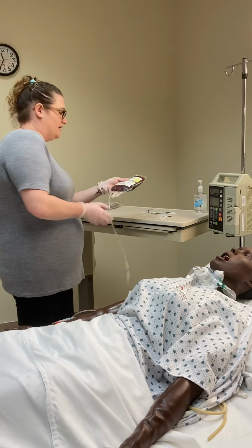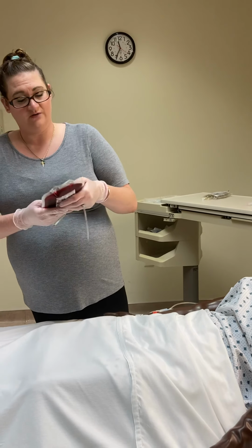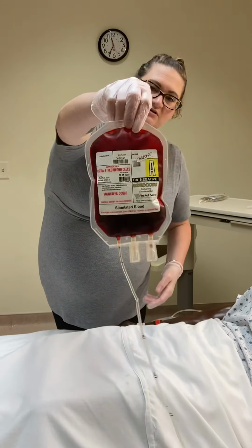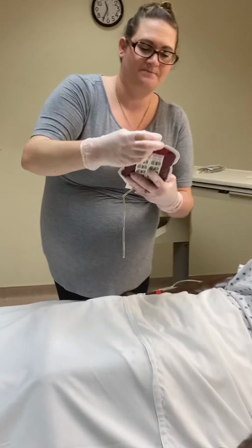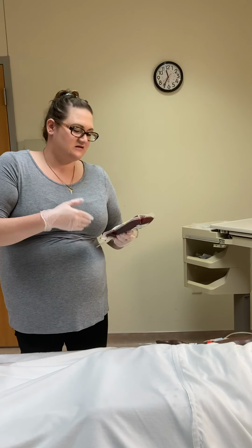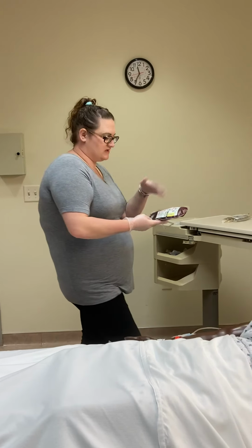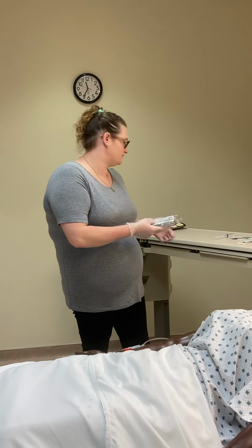I'm going to go and get the blood, go through that whole process of dual signing everything with the blood bank. You could have a nursing assistant go and get it for you, as long as it's okay per your facility. And this is what your blood cell is going to look like. This is simulated, but this is what the bag would look like. It'll have the collection date, the unit number, when it expires, the type of blood that it is. This example is A negative. It'll say volunteer donor on there. If it was their own blood, it would have their information.